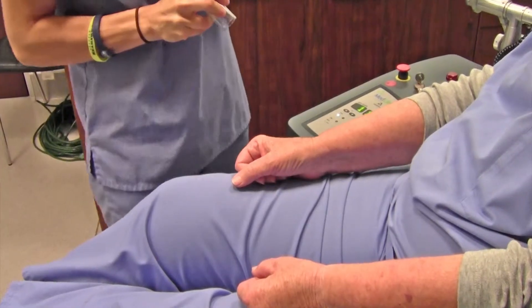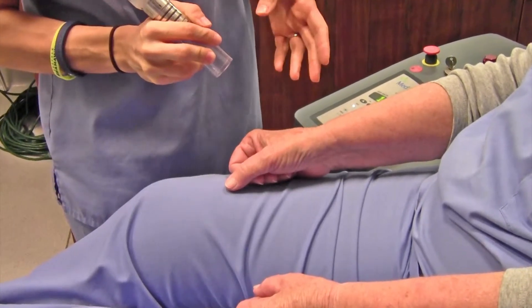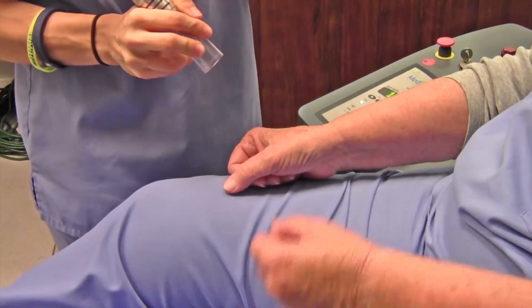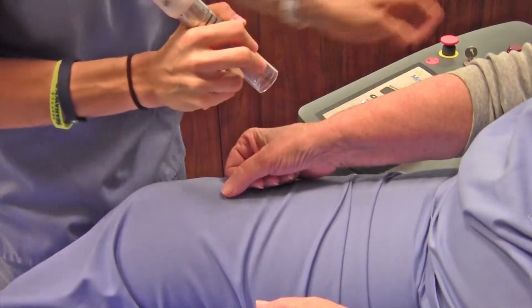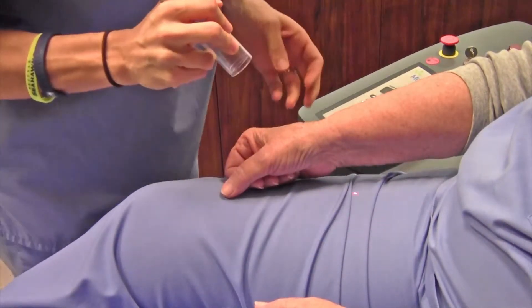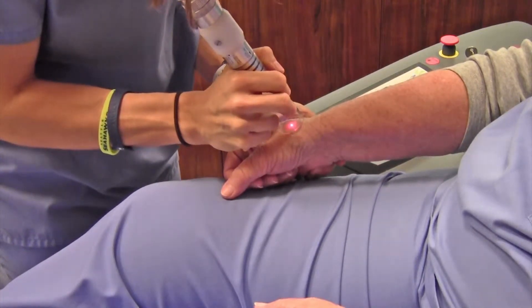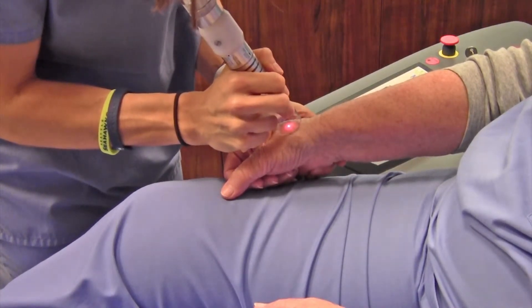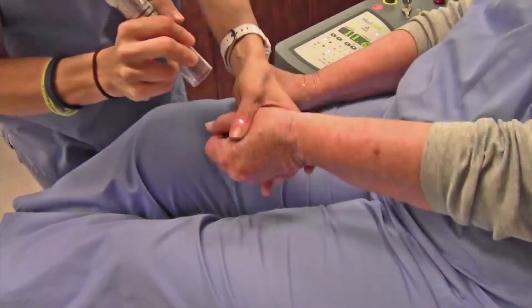Okay, are you ready? I'm ready. So typically, when we treat a small lesion like this, we don't do any numbing, and it just kind of feels like a rubber band snap. Here we go. So that's all for the one hand, and now we're going to treat the other one.